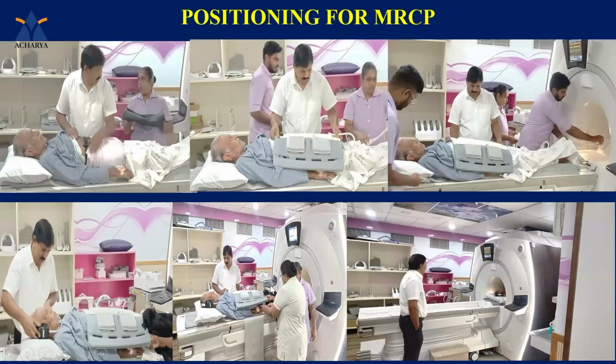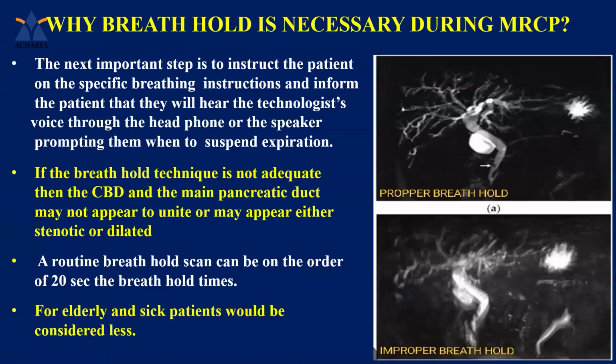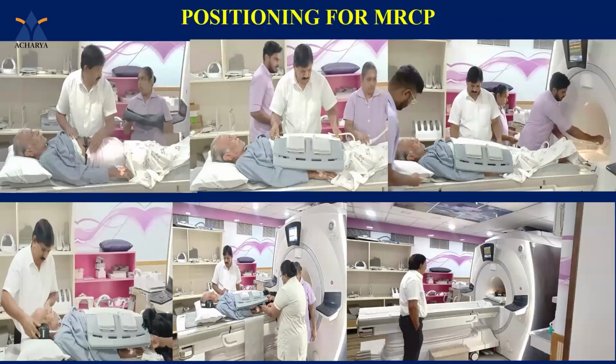Next, you always have to give breathing practice on the table, and after that you check the waveform on the monitor. Then you go for scans. This is the positioning for MRCP.